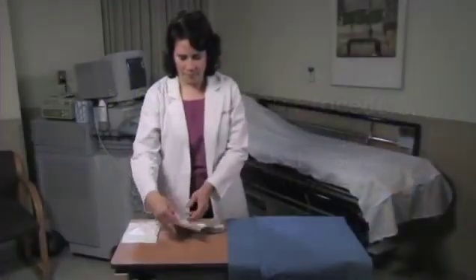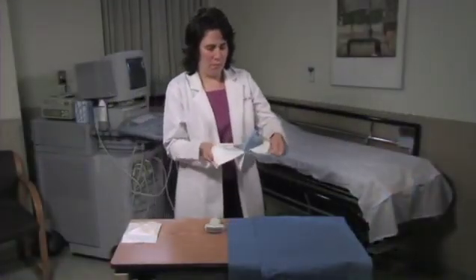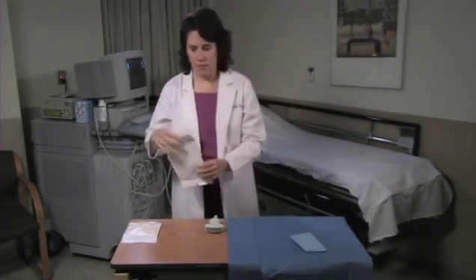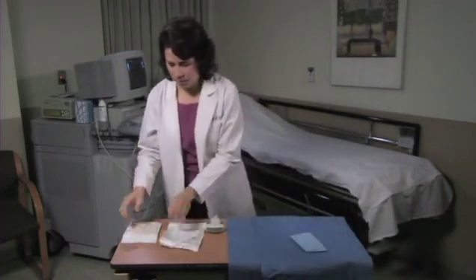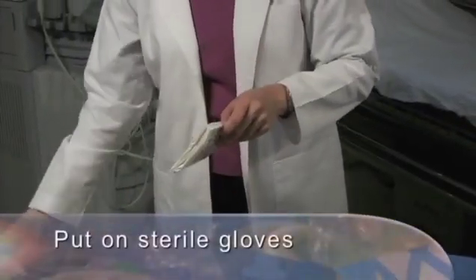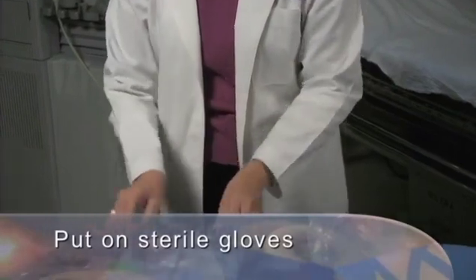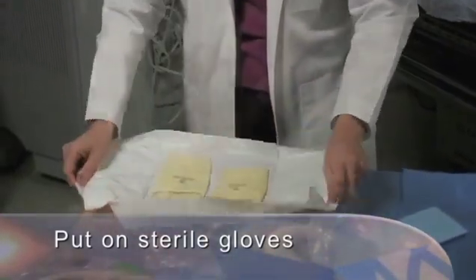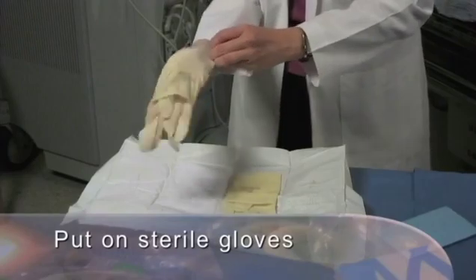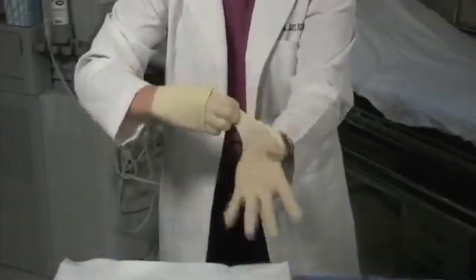First, establish a sterile field by opening a sterile drape or procedure kit. Drop the cover and other contents of the pack onto the sterile field. Next, put on sterile gloves using standard technique. Open the pack to expose the cuff area of the gloves. Touching only what will be inside of the glove, get the first glove on and then the second glove.